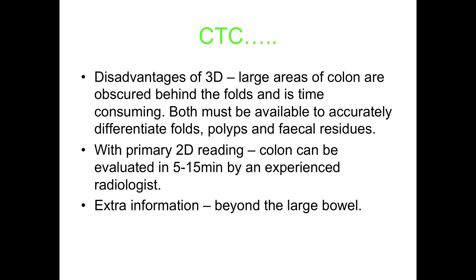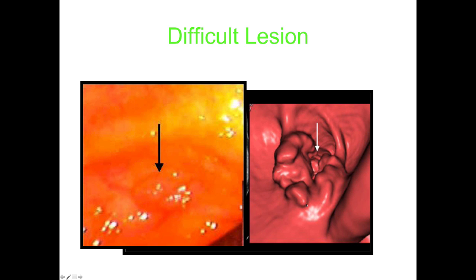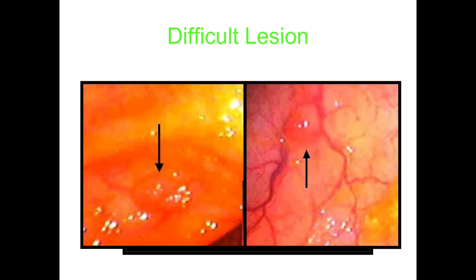A disadvantage of 3D is that a large area of colon is obscured behind folds, and if you're not careful you can miss a lesion there. These are difficult lesions. In this part of the sigmoid colon, flat lesions can sometimes be easily walked past if you're not looking carefully, but if you know to look for them they're quite obvious, both in the fly-through view and on optical colonoscopy — where a flat lesion is also a challenge for colonoscopists.